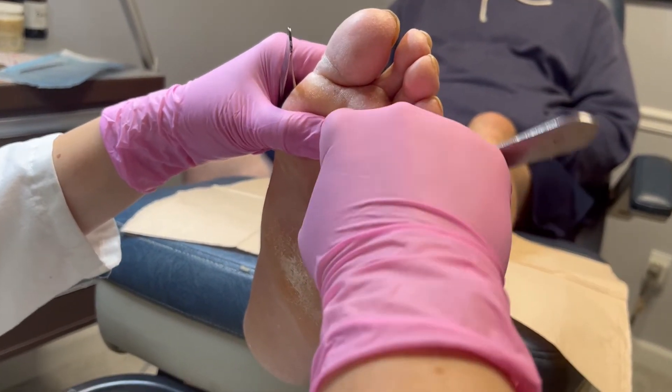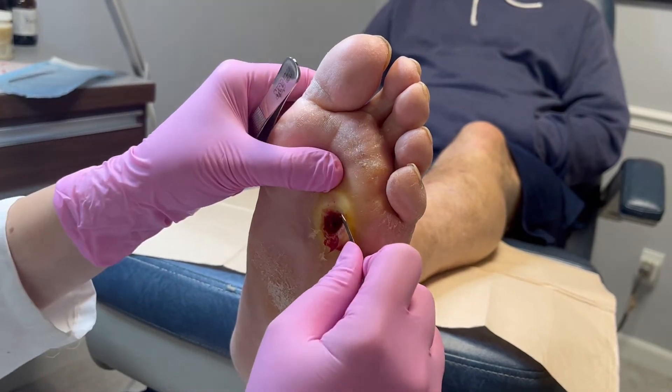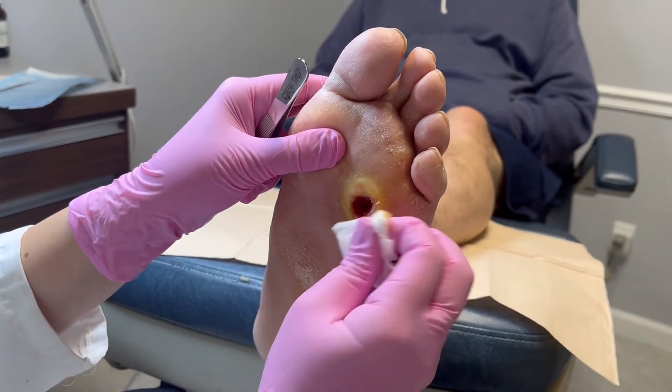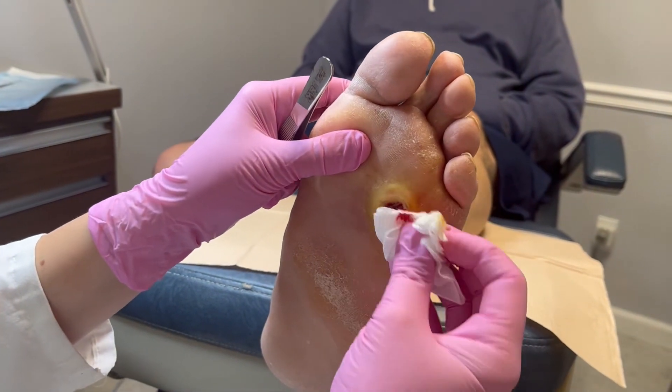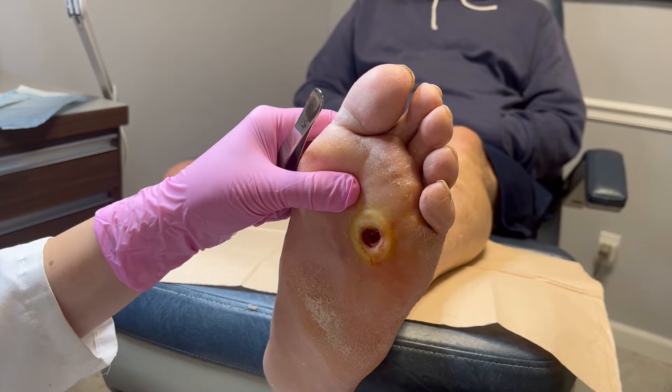There's a little bit of maceration on the borders. This is draining well. Just getting that one piece out.